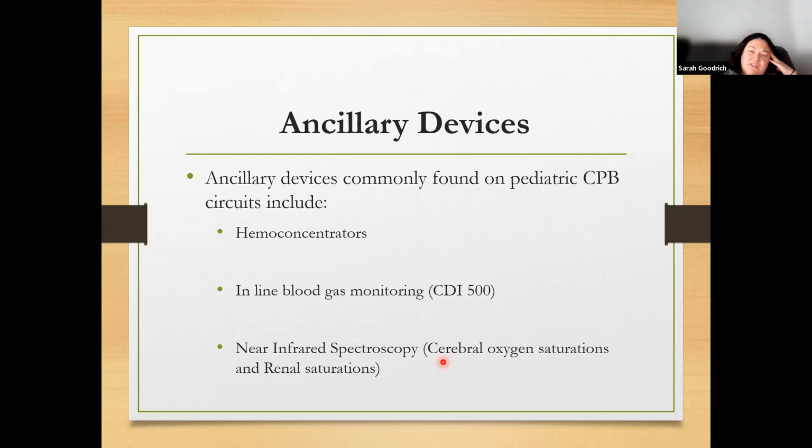Would you do pulsatility? Sorry. Or go, Emil. So will you first of all check to see if the pad is well positioned? Then second, will we check perhaps the hemoglobin? Yes. So at that point, and I agree, if the pad looks off, it doesn't hurt to go under the drape and see that the pad's still on. If things look a little wonky on the monitor, it's a good thing to check. And I have at times asked the anesthesiologist, can you check, does the pad look like it's still on?